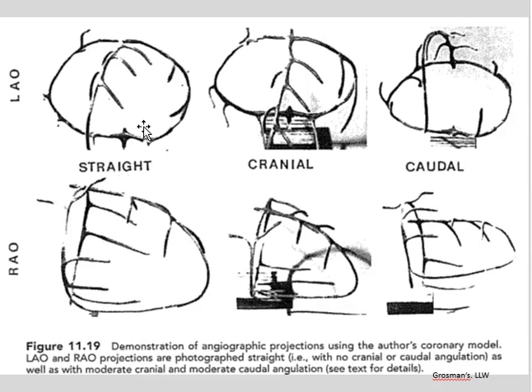This is a nice way to illustrate that 3D structure in a flat plane. These views are all in the LAO, the aortogram view. In a straight LAO, you're looking at the heart end to end. Think of a rugby football with the LAD along the seam coming out of the screen towards you, as opposed to the RAO, where the rugby football is on its side, and that is the seam, the LAD coming down here. And the cranial view is looking at the heart from higher up.